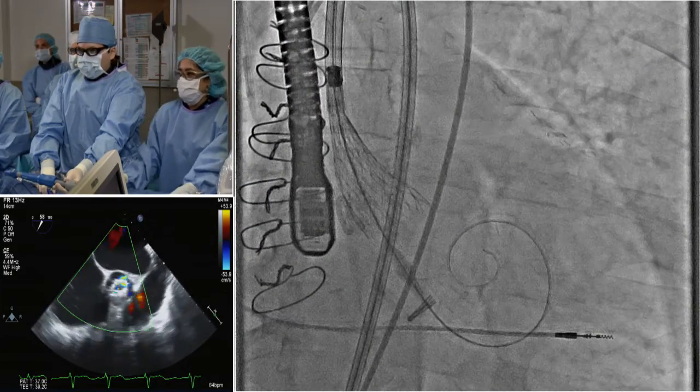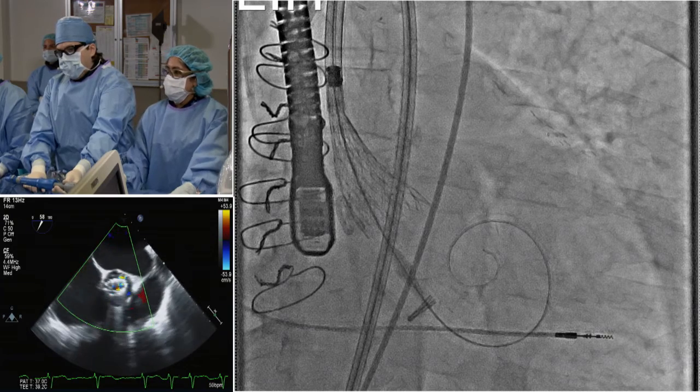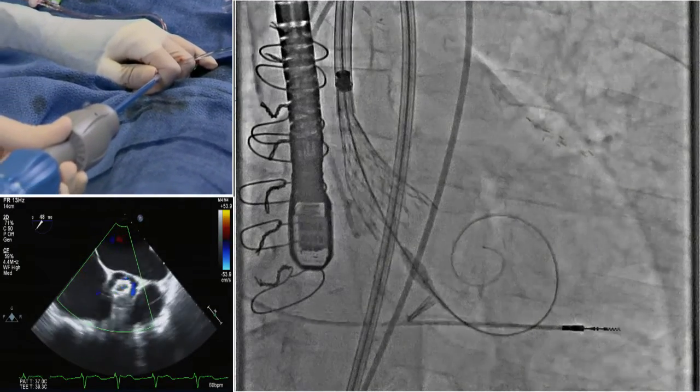Okay, so we're just going to show you the echo. So Patrick, if we could just talk to them about what you see in terms of AI. Yeah, so here you see in short axis, so there's, I would say, like mild AI on the posterior side.